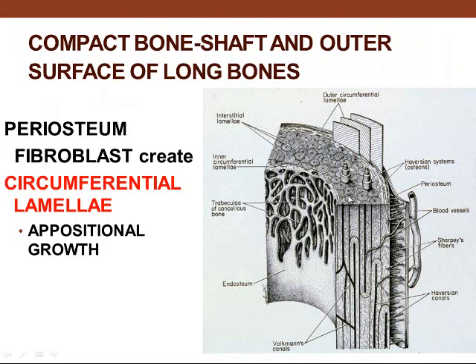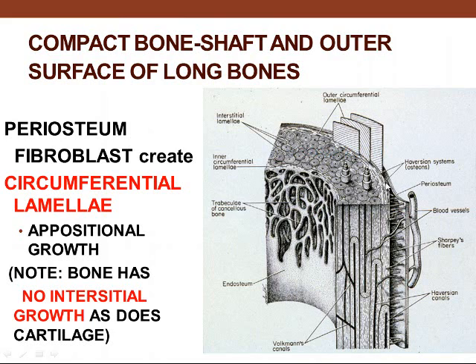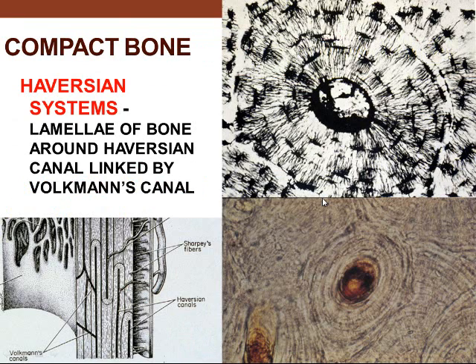Here we see compact bone, and we can see the osteons, each one of these circled there. Haversian canal running through there. The Volkmann's canal is running through there. You have endosteum and periosteum, both of which have differentiation of cells to make bones thicker, and so you have inner circumferential lamellae or outer circumferential lamellae, which resulted from differentiation from the periosteum or the endosteum. And so here we see one of those Haversian canals.